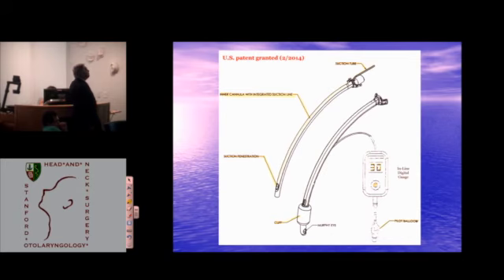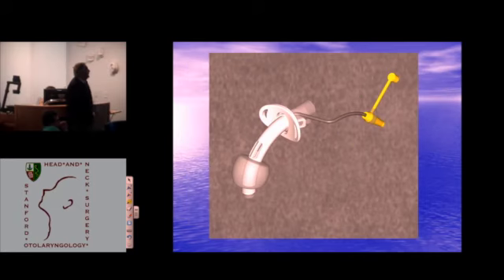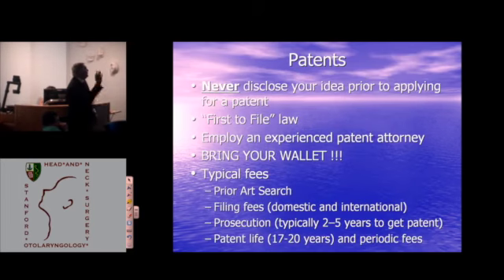So next slide. And so this is on our trach tube. This is the suction built into the wall of the disposable inner cannula that goes into the outer cannula. And that same concept will be built into the endotracheal tube disposable inner cannula. Next slide. And you just see the two together, and we're suctioning. And again, you can see the band has been put inside the cuff so we can bring the fenestration right to the edge of the cuff without interfering with its attachment to the tube.